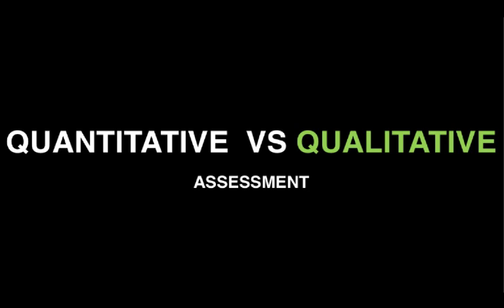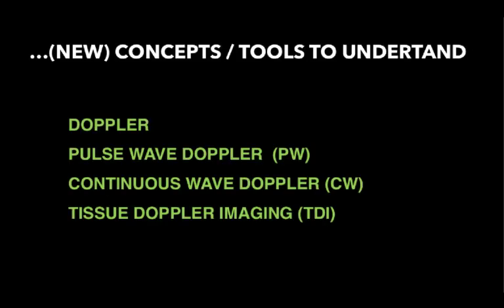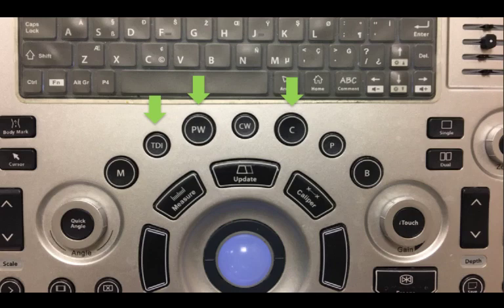And for that, we're going to need a couple of new tools. So how are we going to do this? You need a couple of, and I say new between parentheses because many of the concepts you are hopefully familiar with. But we do need to make sure that you understand these concepts in order to apply this information appropriately. These are all functions that exist within your machine and your equipment right now.